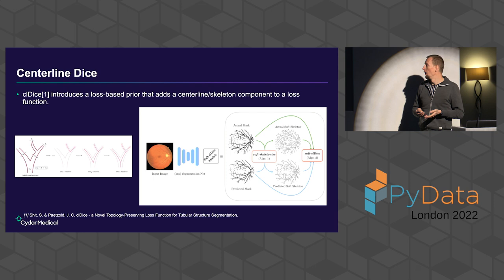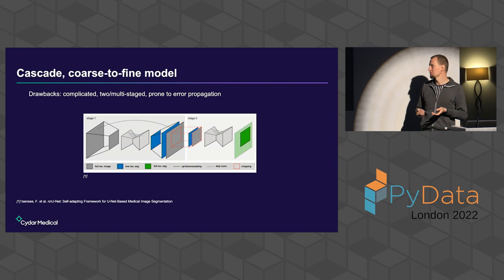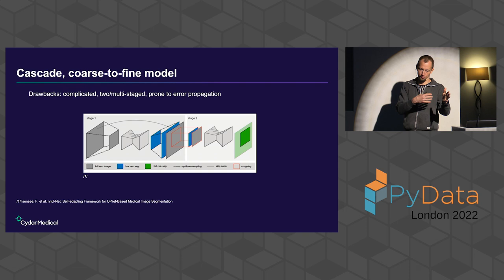Okay, what are other challenges? I will just briefly cover the technical challenges, so to say. 3D segmentation models, especially large organ segmentations, require tons of memory, because if you want to pass a volume of, you know, 500 by 500 by 500, it's quite a lot if we want to train a network on it. And there are a few solutions for how to overcome it.